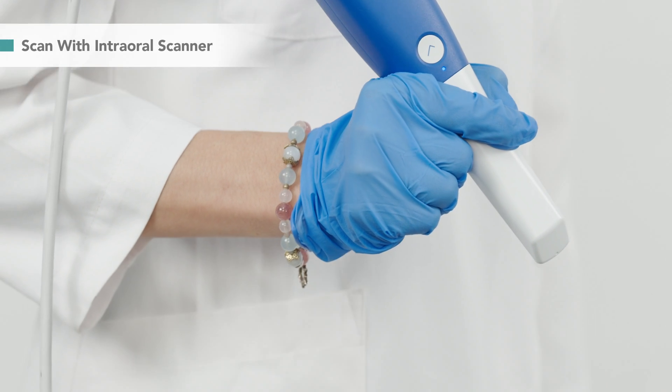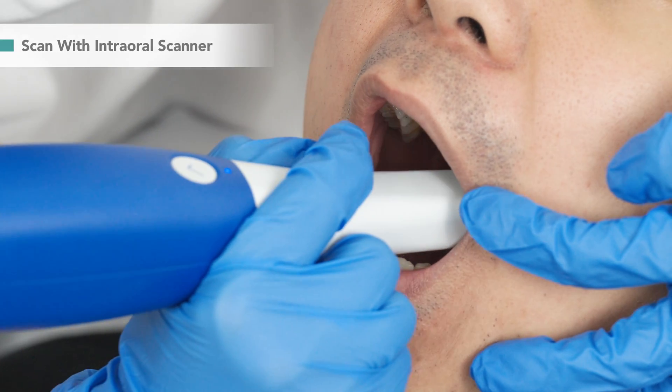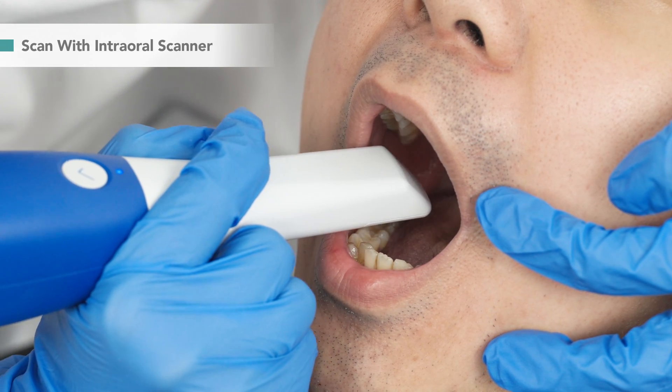We start by creating a digital impression of the patient's teeth. With any intraoral scanner, you can quickly scan each tooth and accurately convert them into scan data.